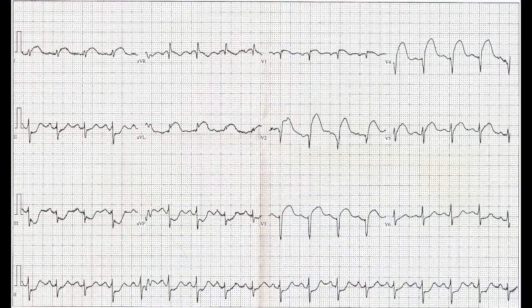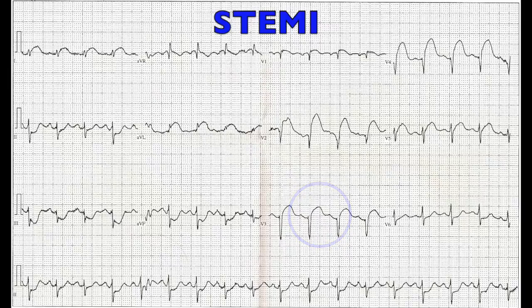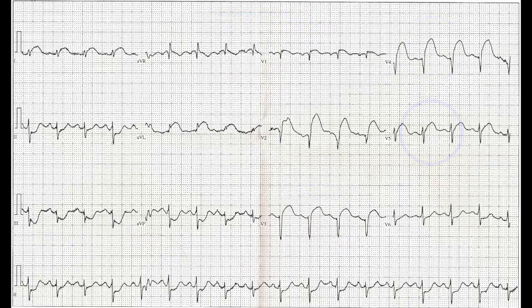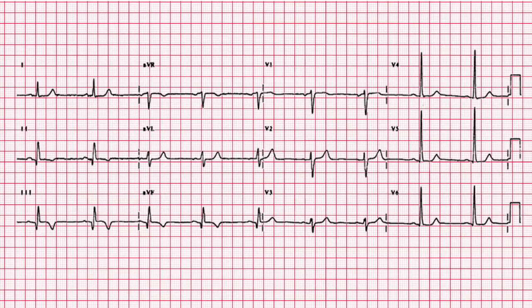The EKG seen here has a noticeable sign of ischemia called ST elevations — a STEMI. The elevations can be seen in leads V2 through V5, so this is an anterior STEMI. In this next EKG you can see T wave inversions in the inferior leads 2, 3, and aVF. If this is different from a previous EKG, it is a concerning sign for cardiologists.